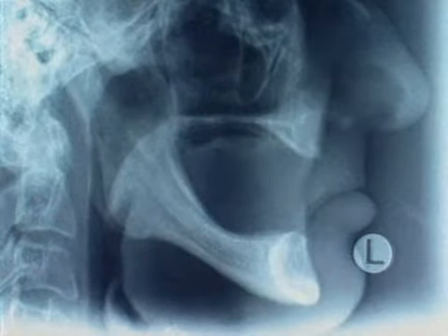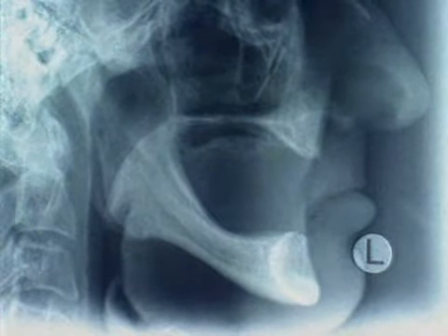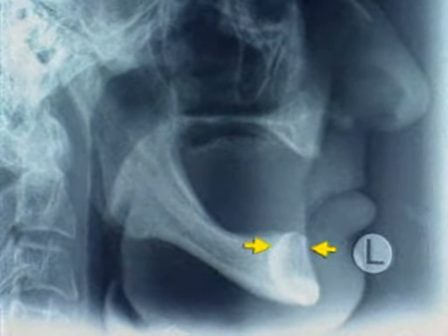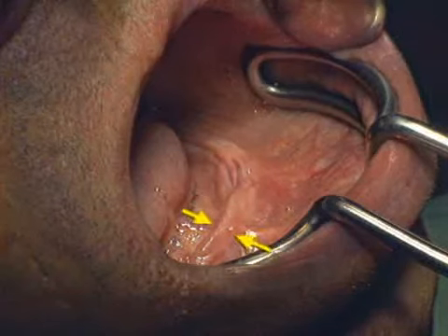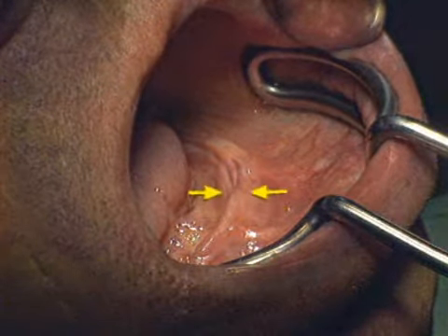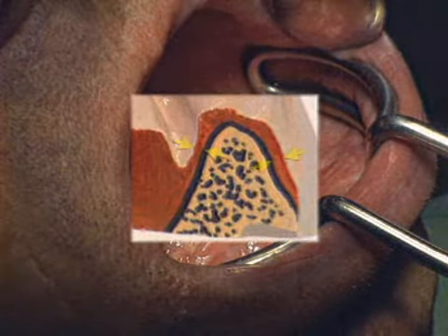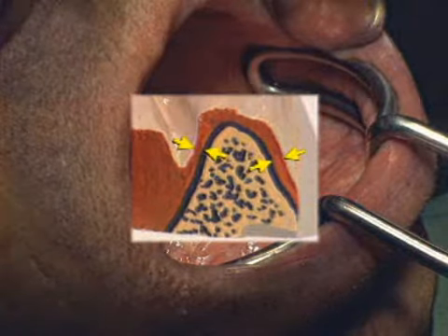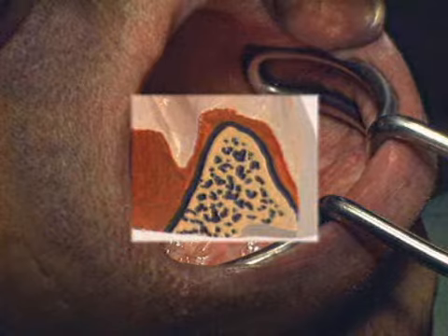Conventional radiographic techniques for metric determination of jaw width, such as side-view teleradiography, as shown here, are only useful in the center of the jaw. Hence, transversal bone availability has to be determined clinically by measuring the thickness of the oral and vestibular mucosa. The values obtained are then subtracted from the total width of the alveolar crest.